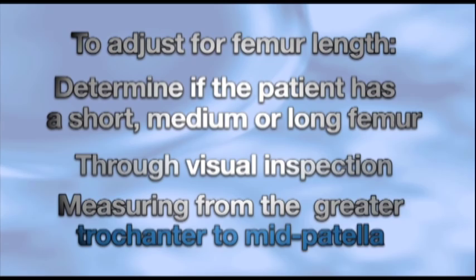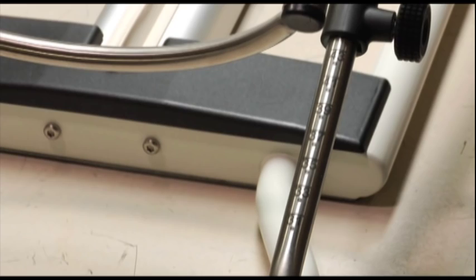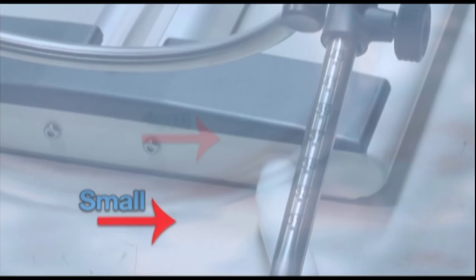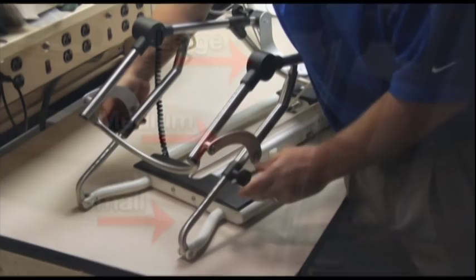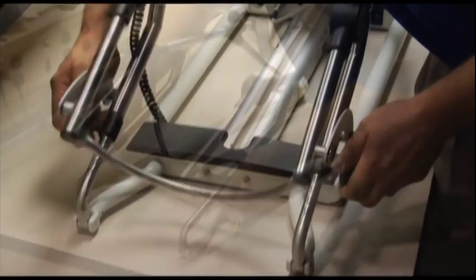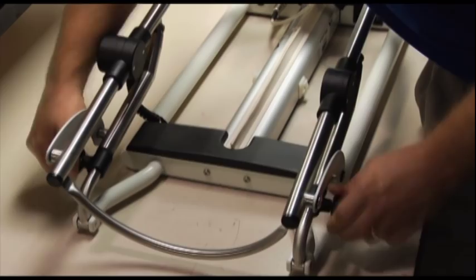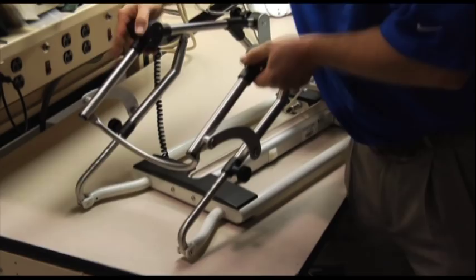Many CPM machines will have a visual scale on the orthosis itself. This scale is usually in centimeters. If no visual scale is present on your CPM machine, adjust the femur length for three settings: small, medium, or large. If your patient has a short leg, adjust the femur length to its shortest setting. Or, if your patient has a longer leg, extend the femur adjustment to its longest setting.